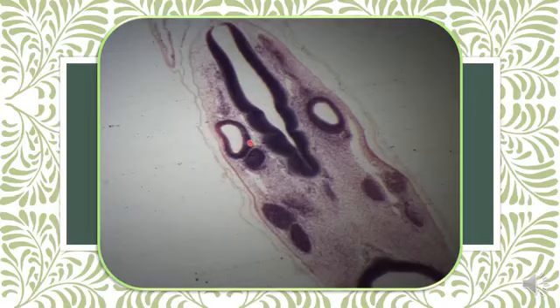Also these sections show, anterior to the ear vesicles, this ganglia is called the acousticofacialis ganglia.